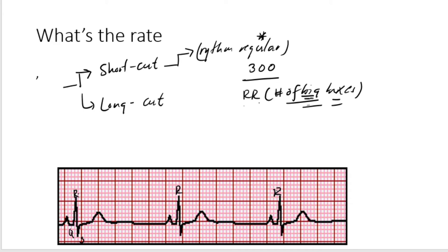So we count the number of big boxes between this R and the next R. We have one, we have two, we have three, we have four, we have five. But then this one is cut. If you see, it has many boxes, one, two, three, four, and again there is cut with one that makes up an additional. This area and this area will form the sixth box, and that's typically what they mean to the nearest decimal.